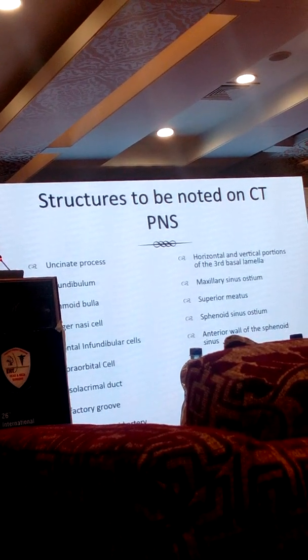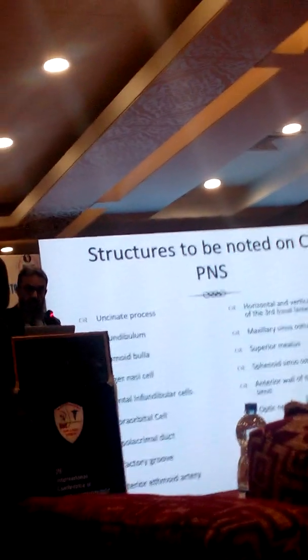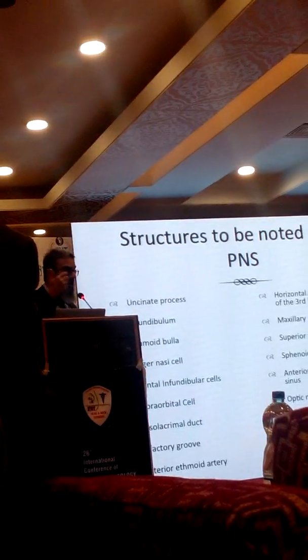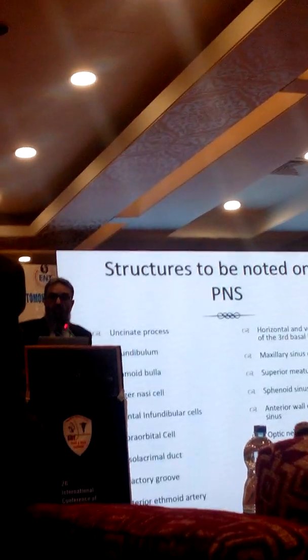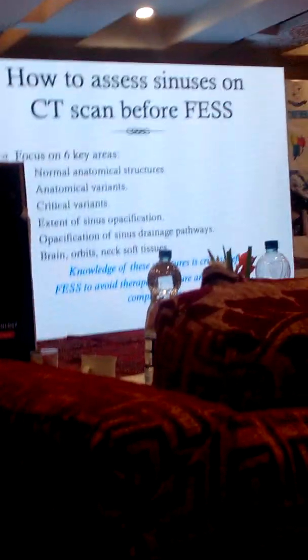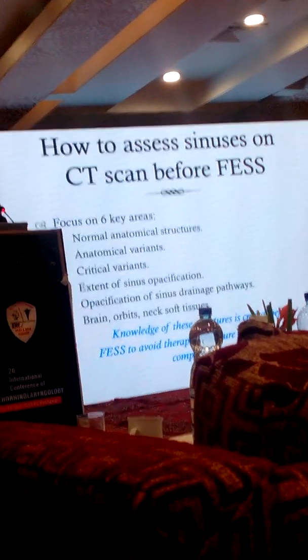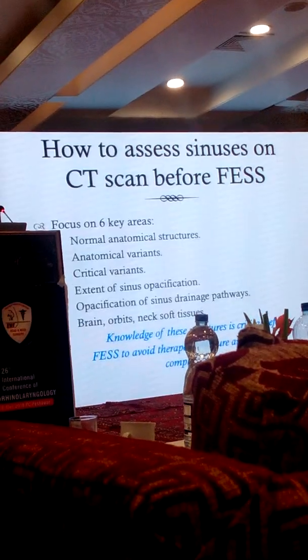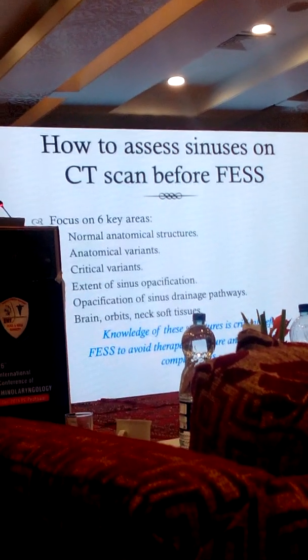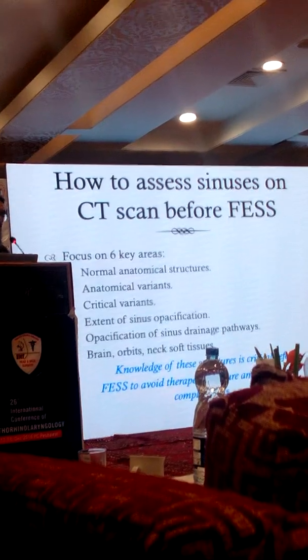I know that with the kind of disease we are seeing, allergic fungal rhinosinusitis, we might not be able to do it. But by the time we are contemplating those, we must have gone through the basics. Okay? Now, as already mentioned, we have to identify the normal anatomical structures. So, like Kanasa mentioned, we should not jump. The moment we see a finding, we concentrate on that.